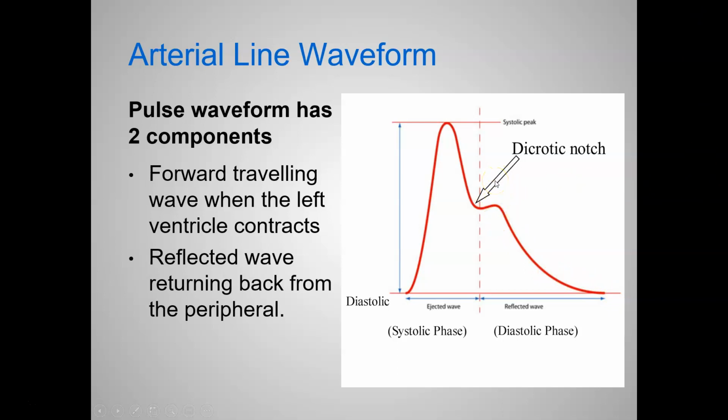It will not always look this way. Let's say it's just like an arch. That typically means there's something going on with the arterial line. Either my pressure bag's not inflated, or maybe this waveform looked like this all day, and then all of a sudden it's down here, a little tiny wave, no dicrotic notch, maybe a baby dicrotic notch. Oh man, my pressures are dropping. Go look to see if your pressure bag's inflated right away.